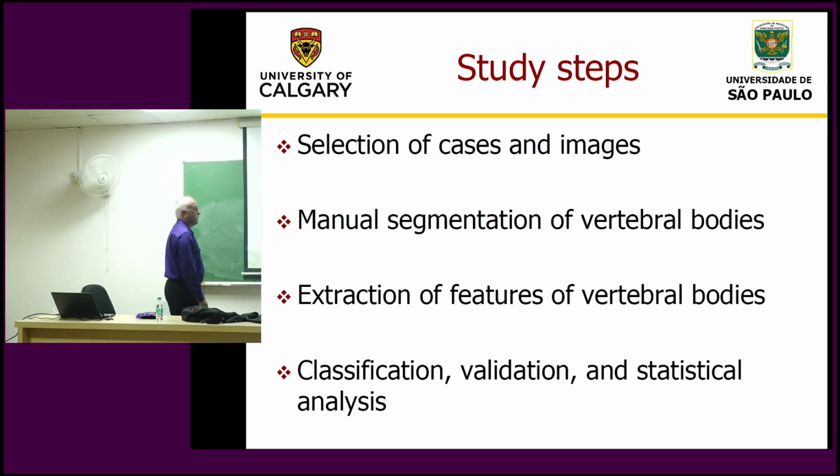So some cases were selected from the hospital through the database, the hospital information system and the radiology information system, HIS and RIS as they're called.